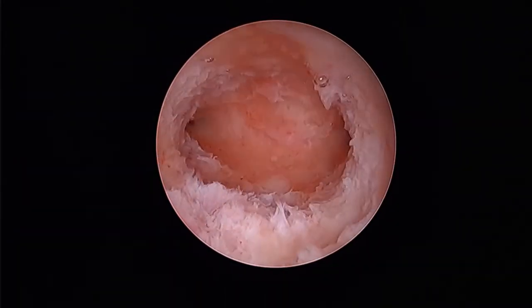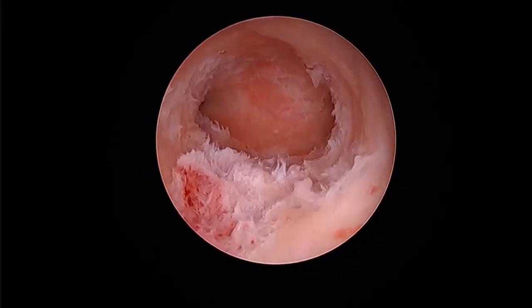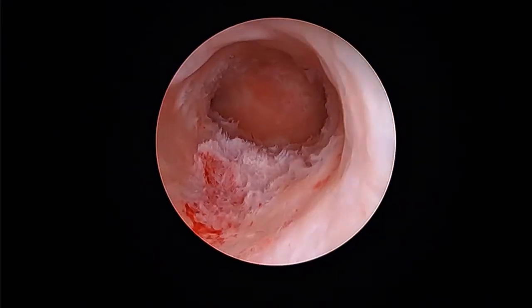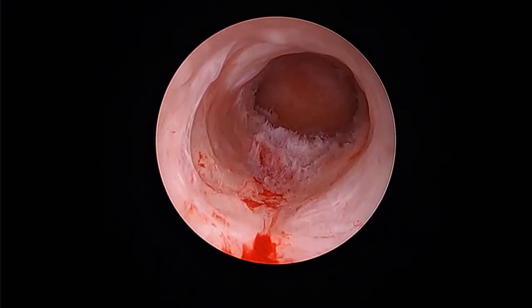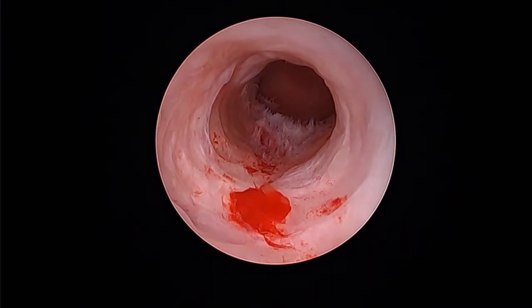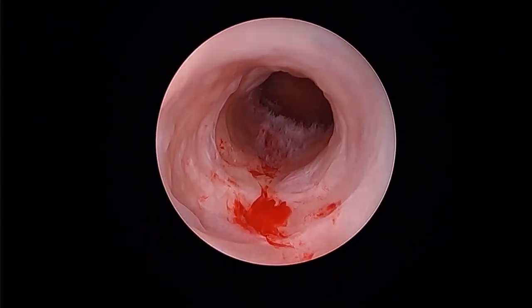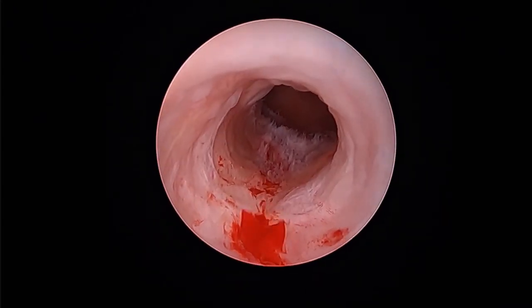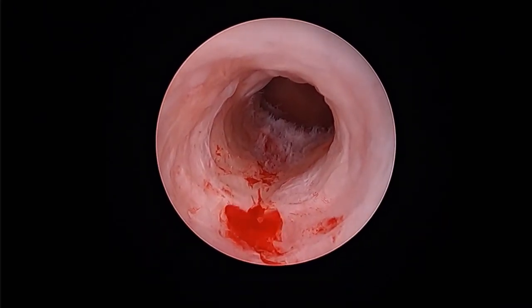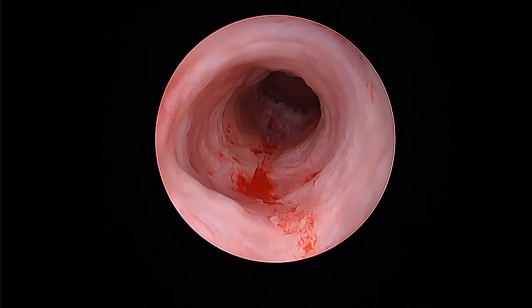We have a hemostatic reduction of the polyp and tissue from the endometrium. This is the endocervical canal, and hysteroscopic polypectomy is complete.